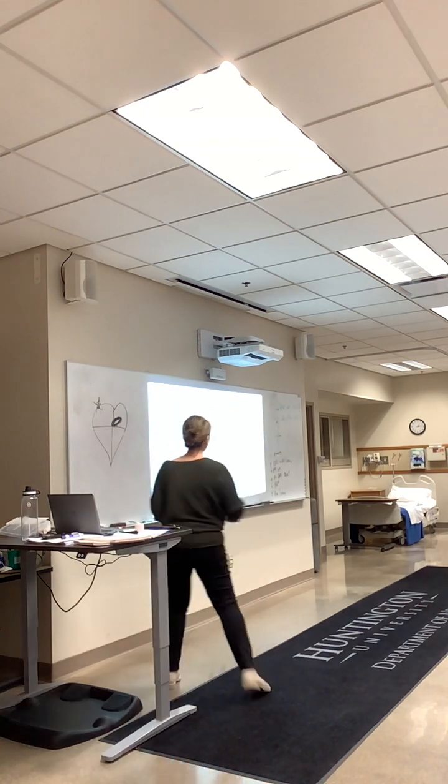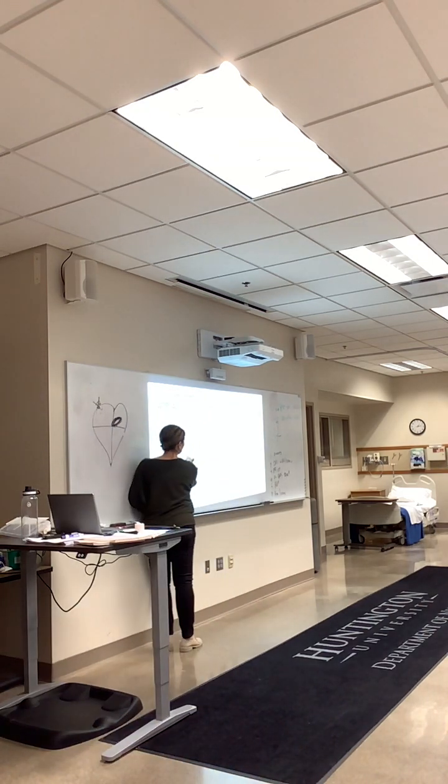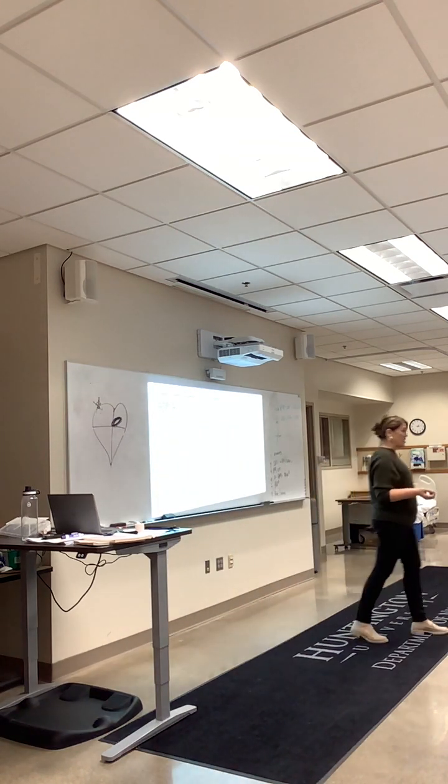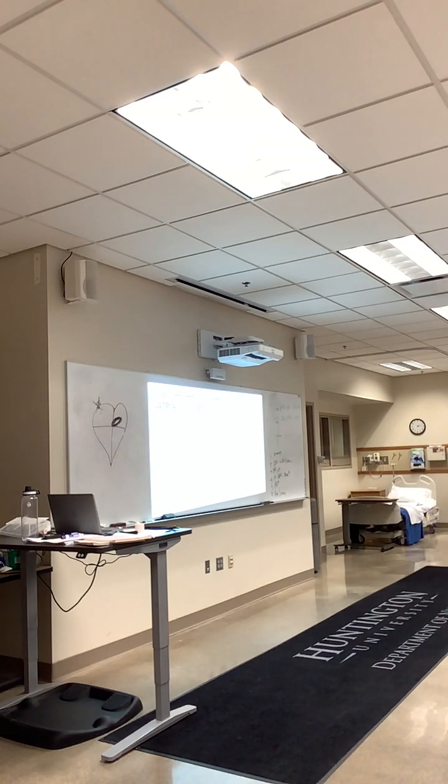Here are just more examples I wanted to show you. If you look at this, you think, oh, but isn't that the T wave, P, QRST? It looks like it, but be careful, and that's why it makes it hard to tell. That's why you kind of go, well, maybe. Do they have other symptoms with it? What's my rate? It tends to be fast, it tends to be irregular.